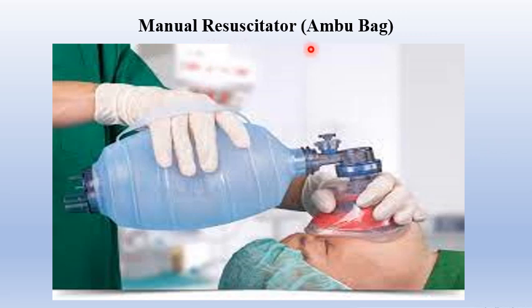Manual resuscitator, Ambu bag, very important to know. It is a backup in case of failure of the anesthesia machine. It is commonly used during resuscitation. Very important device.